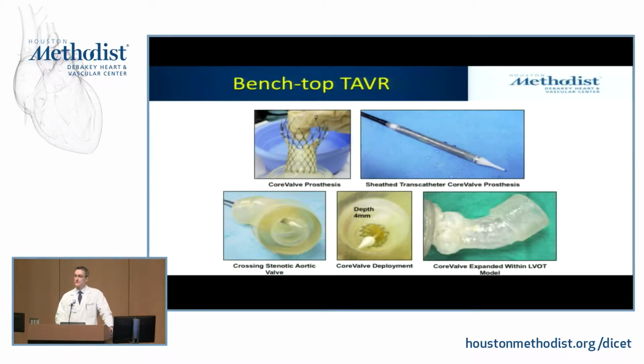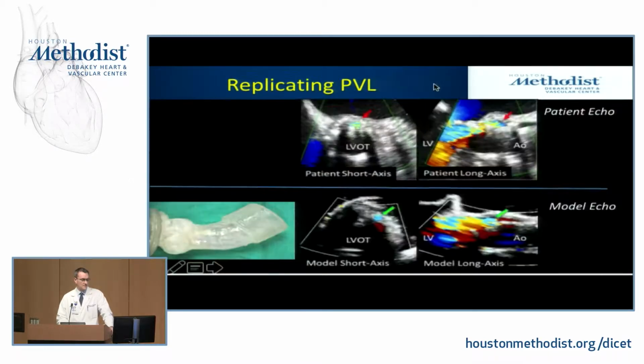And that gives you the ability to do things like this. You can actually do a tabletop TAVR. The idea being you take a patient-specific aorta, you can do a tabletop valve implantation at the same depth or the same height that either you want to achieve in the patient or that was achieved in the patient.